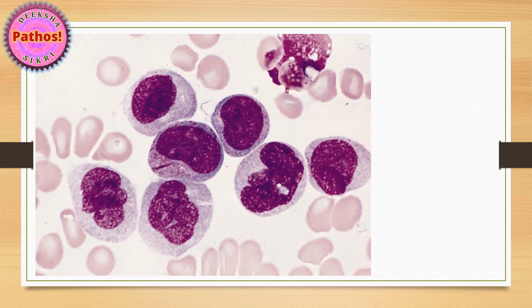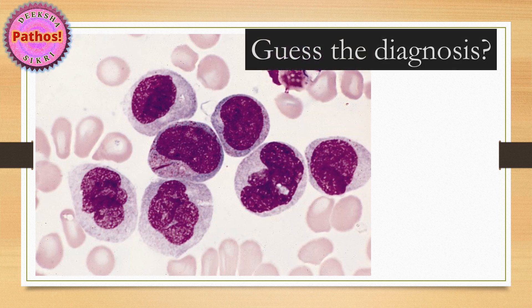Now have a look at this slide — take a moment and see if you can identify that there are two types of cells. Think about what the diagnosis could be. There is one cell right in the center with an Auer rod, and the rest seem to have that same folded, creased nucleus. So you have a mixture of both myeloblasts and monoblasts here. This is a kind of acute leukemia called acute myelomonocytic leukemia in FAB classification, also called AML M4. For those who got it correctly — congratulations. For those who didn't, go back and look at the photographs again. I have covered classification of leukemias in a similar video — please have a look at that as well.